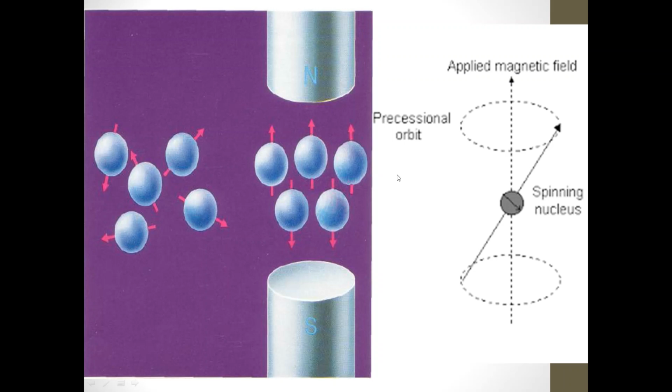Today we will continue talking about MRI basics, and we'll continue after longitudinal and transverse magnetization. We will talk about MRI signal and T1 and T2 and the proton density sequences in MRI. But let us talk again and briefly about what happened before.